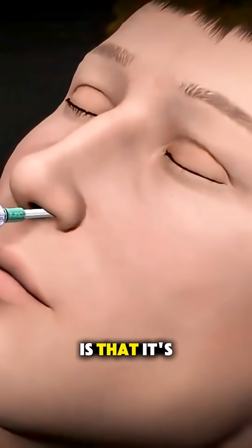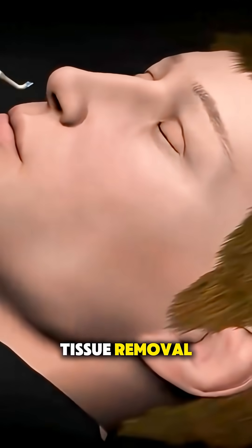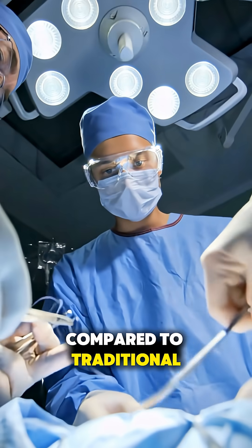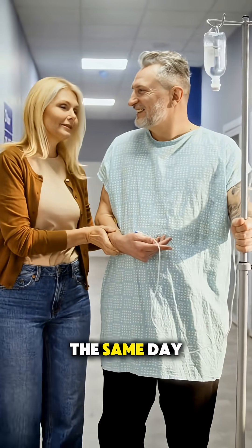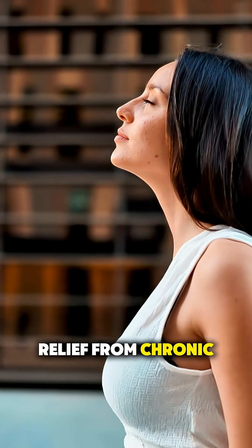The best part is that it's all done through the nose — no cutting, no tissue removal — and most people experience much less pain and faster recovery compared to traditional sinus surgery. In fact, many patients go home the same day breathing easier and finally finding relief from chronic sinus problems.